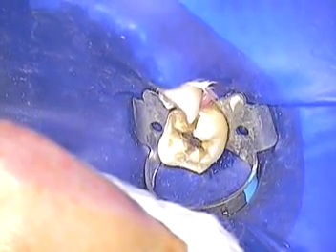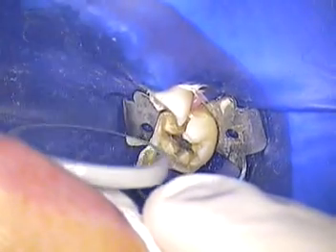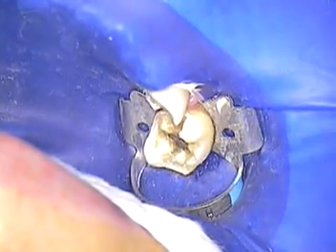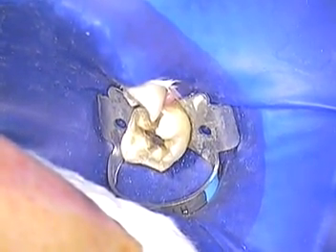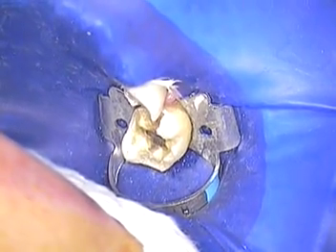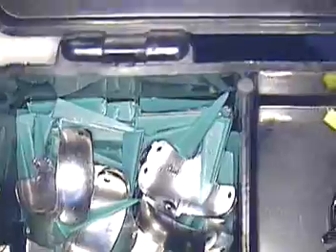Hey guys, Jerry Cuomo back. This next step will give us an opportunity to show you how we fill tooth numbers 29 and 30. To do that I'm going to use a little kit called Composite Tight by the Garrison Company. I'll show you what that looks like here off the microscope. I'm using a Leica MS5 microscope from Expanding Images — the Opti-Link microscope system.